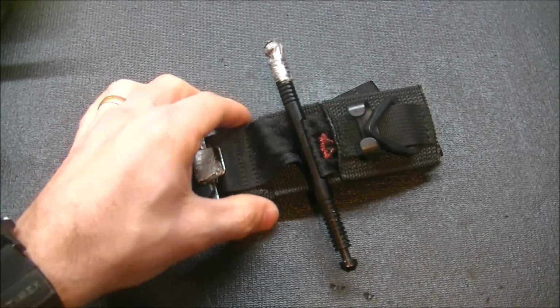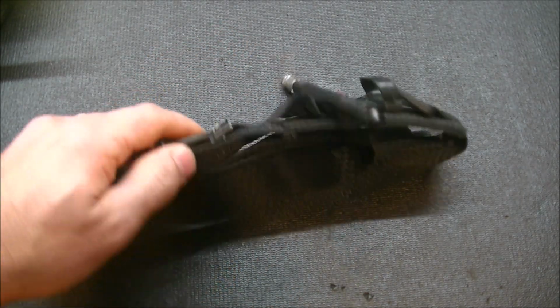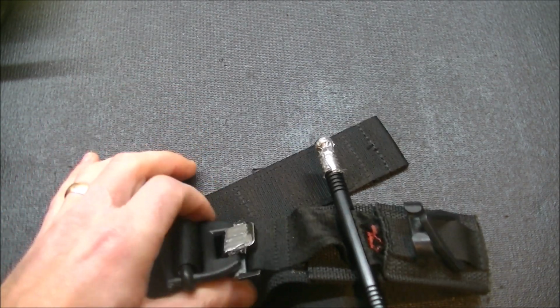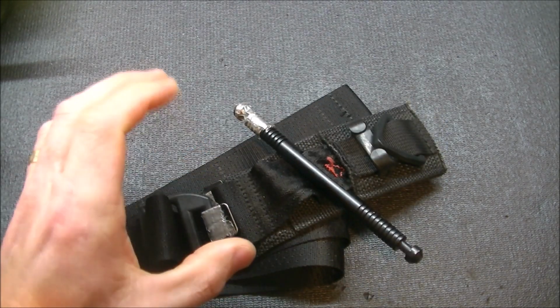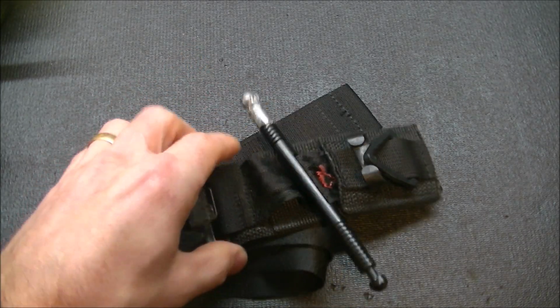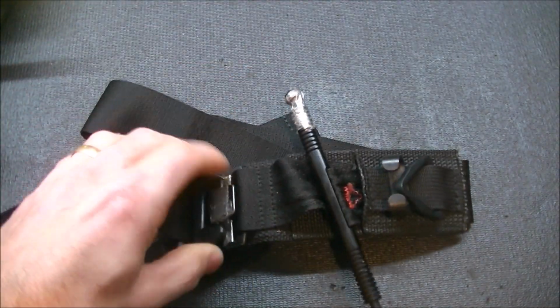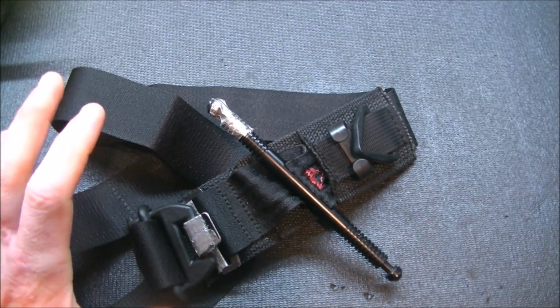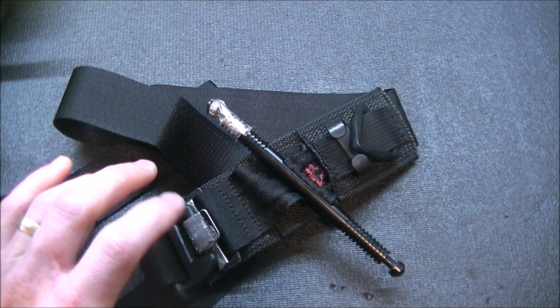Also, this does have a good amount of metal in it, so it's got a metal windlass. This is metal right here, and it's actually cheap little cast metal. Not cheap in the sense of quality, but cheap in the sense of being relatively thin. So it does echo a bit. If I didn't have this duct tape on here for silencing, this thing would jingle a lot more than it does. Now it just sounds kind of like plastic on plastic jiggling, because that's all there is left. Just that little bit of loosely applied duct tape was able to silence it.